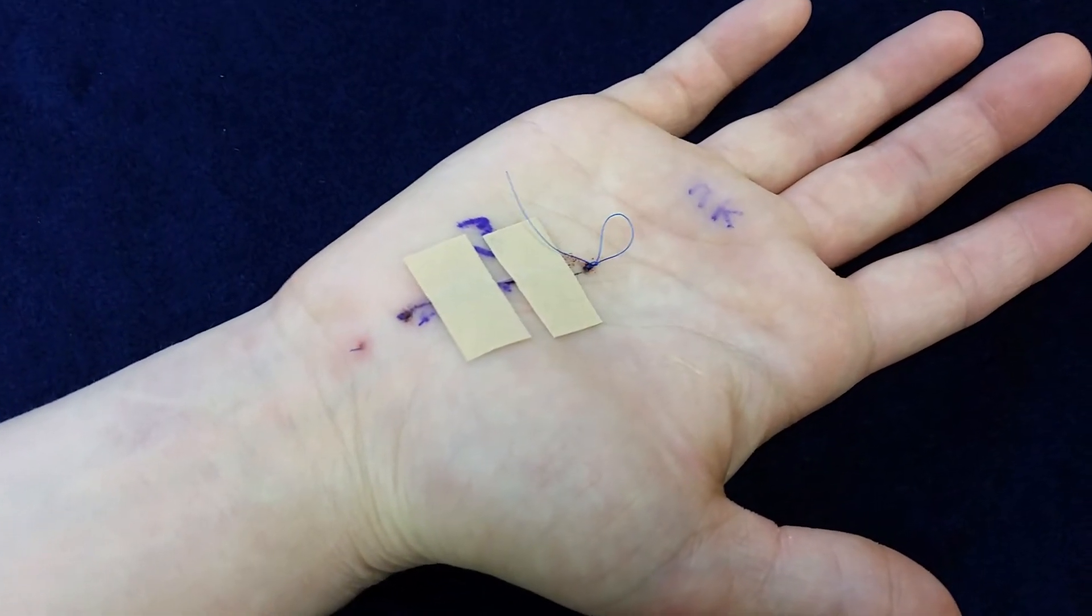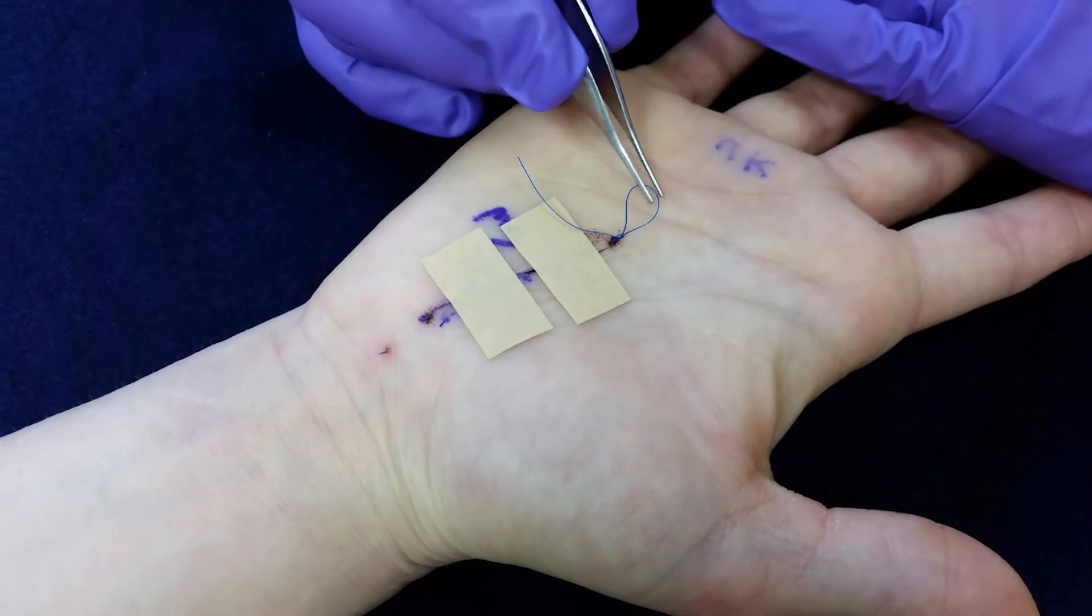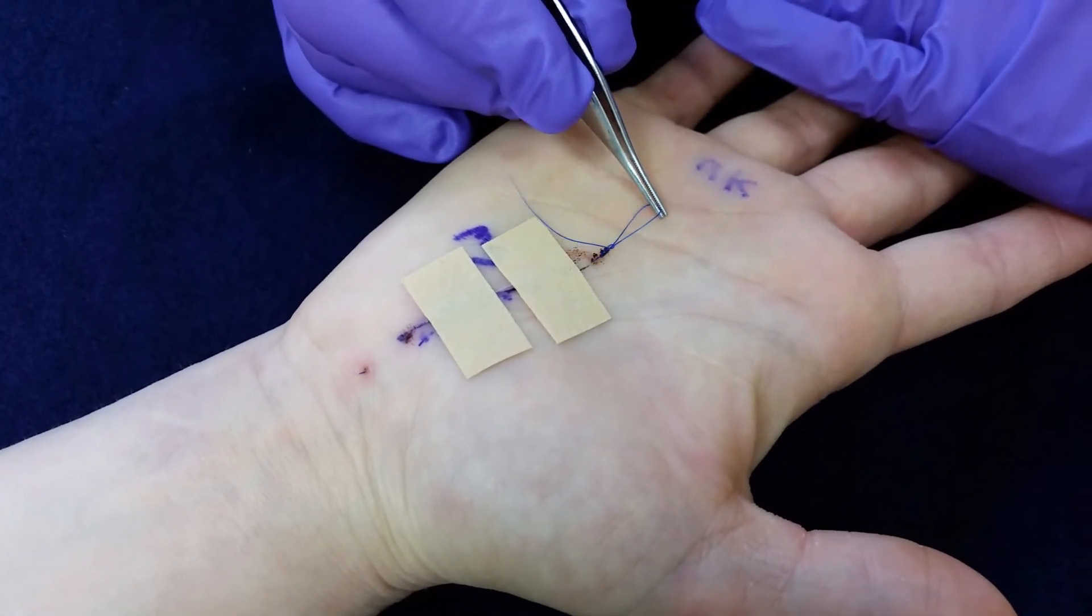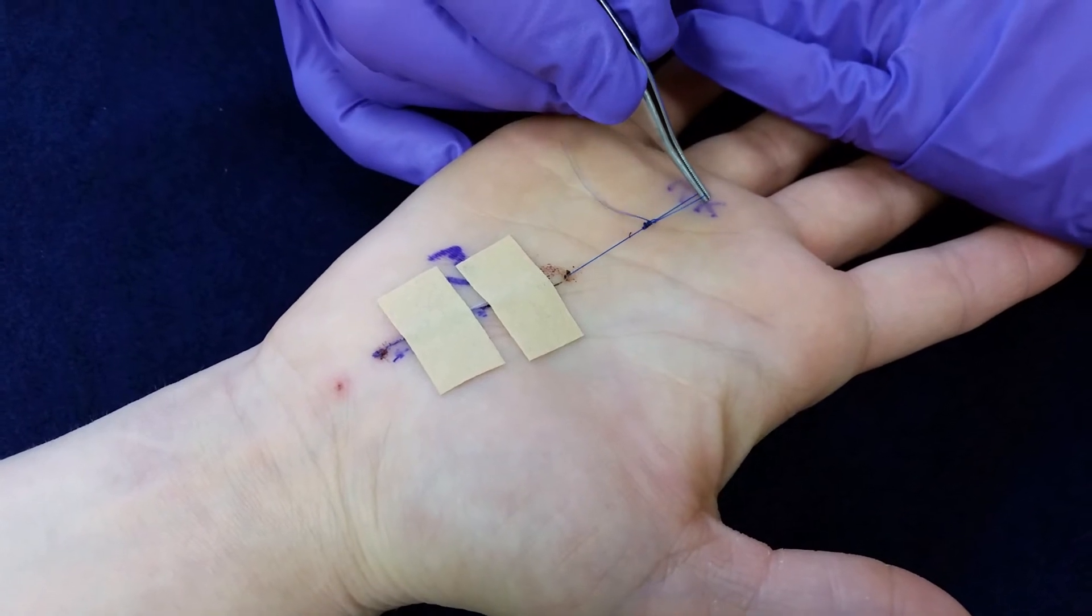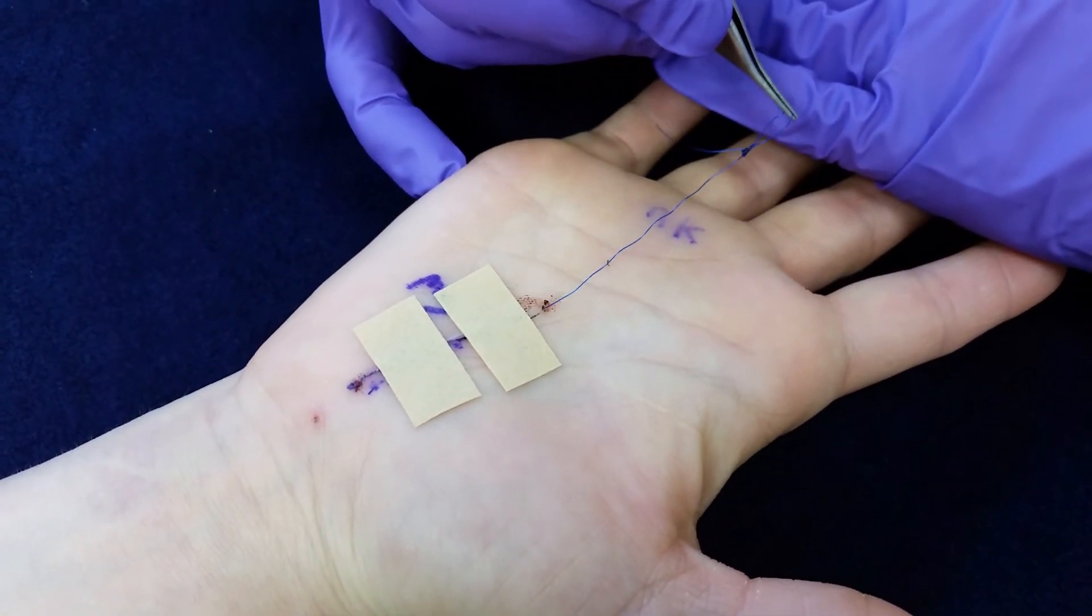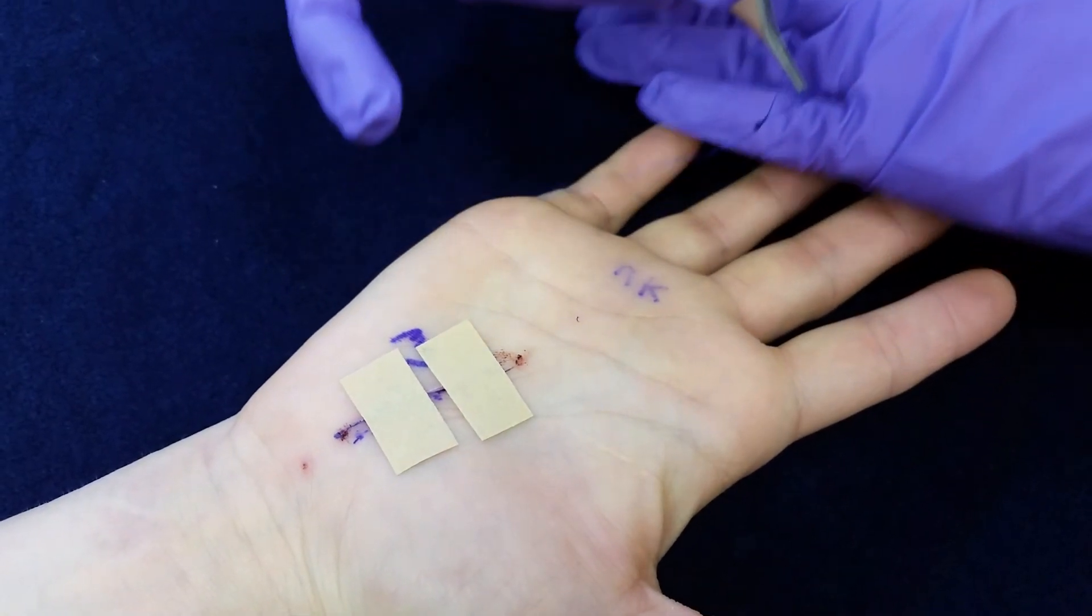And then the other side of the loop we're just going to gently pull. Not with great force, we're just going to slowly pull it out. It's a single stitch all the way through and you'll see it just comes out like that.